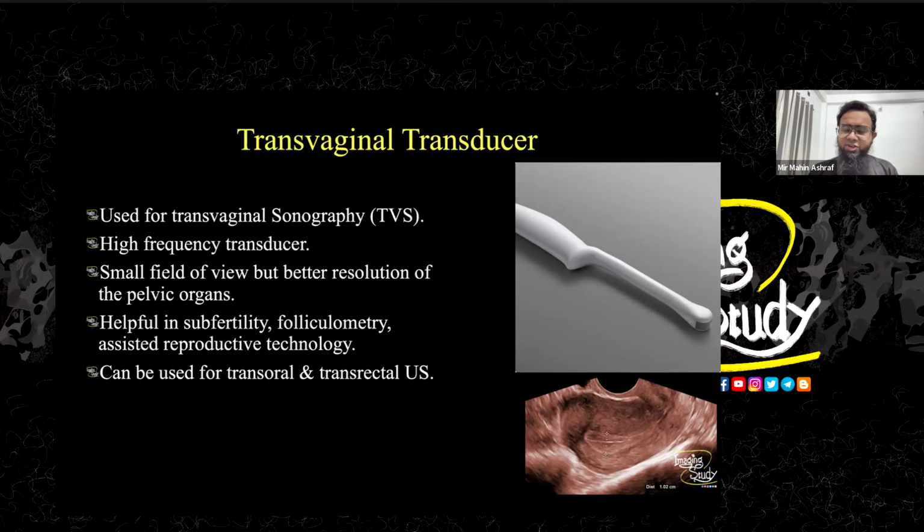We also use it for transrectal ultrasound if there is no transrectal transducer available, which is very common in my country. I don't know about yours, so don't forget to tell me what happens in your country about transrectal ultrasound. Now, I also use it for transoral ultrasound. Sometimes people come with oral cavity lesions, like tongue lesions or some cheek lesions.